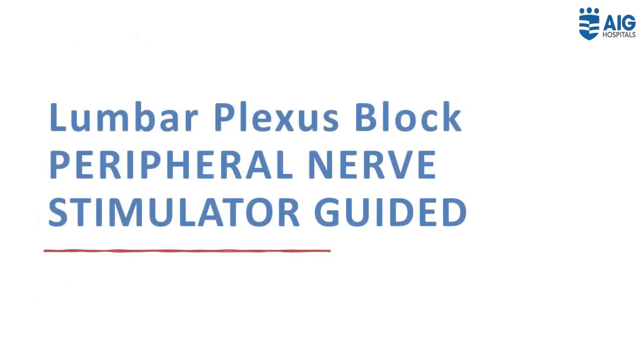The methods of lumbar plexus block we will be discussing now are the PNS guided ones. Traditionally, lumbar plexus block is performed using surface anatomical landmarks to identify the site for needle insertion and eliciting quadriceps muscle contraction in response to nerve electrolocalization.